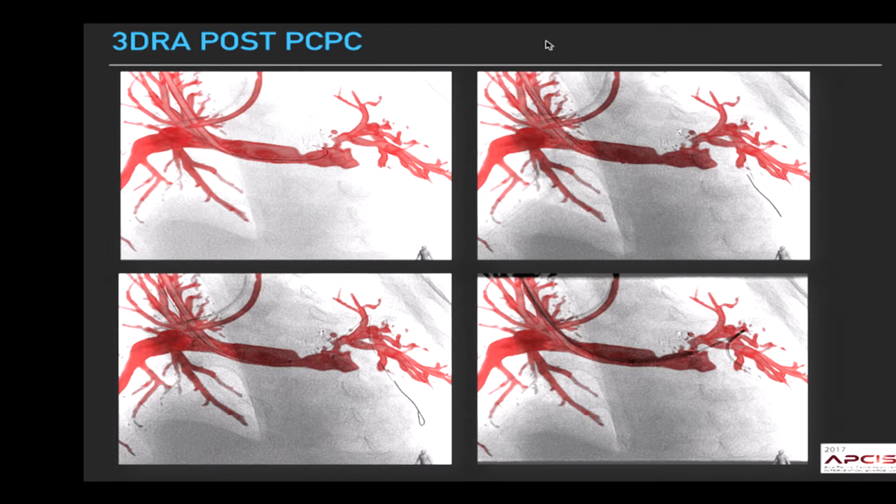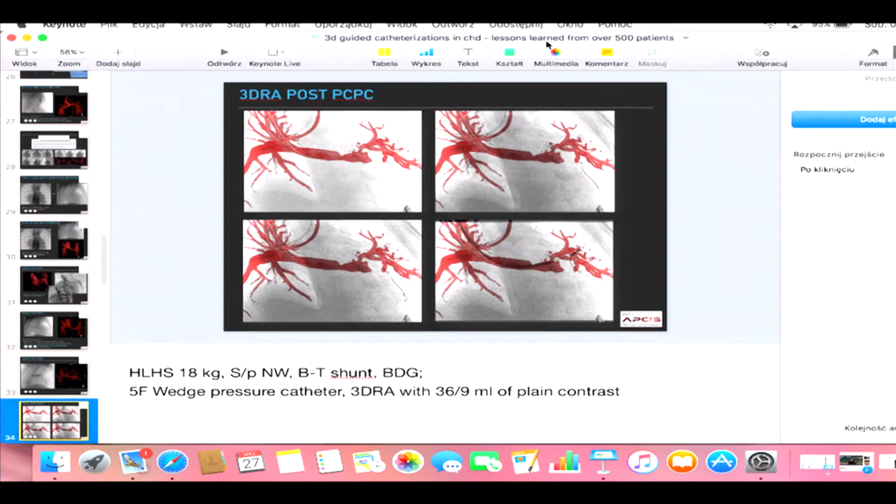And you can see that initially we go with the coronary wire to perform balloon dilation. Later we have a stiffer wire. In this case, there is not that much mismatch, but sometimes we decide to use a coronary wire to introduce stents. Although I know it's not a common way to do it, that may lead to less misalignment.